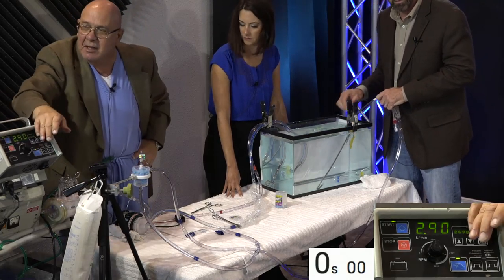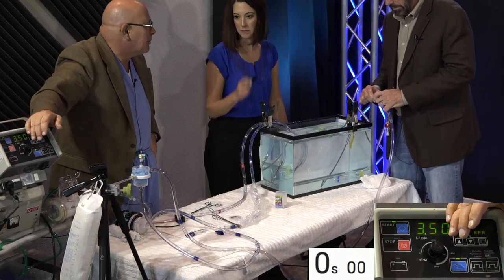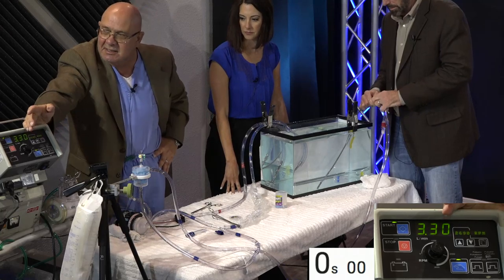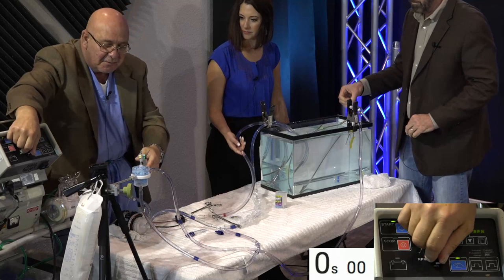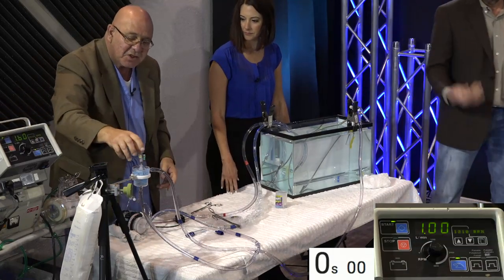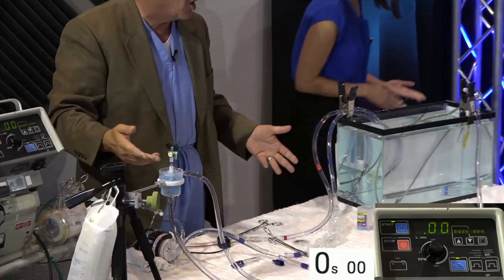How long were we without? Well, we went over, obviously, but I think the first example was a much more realistic example. It was a very short period of time. And look at this, the filter is completely clogged. Look, your patient is so much better. You can now discontinue everything and send the patient home as planned.